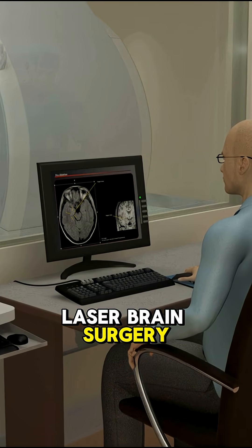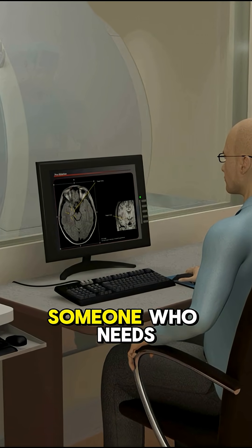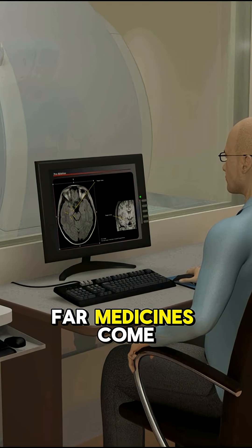Ever heard of laser brain surgery this precise? Tag someone who needs to see how far medicine has come.